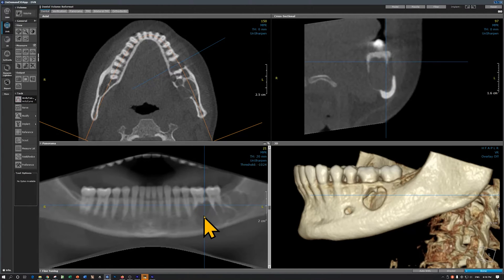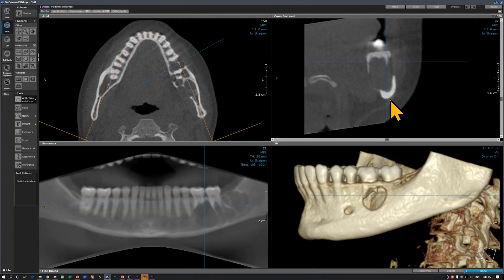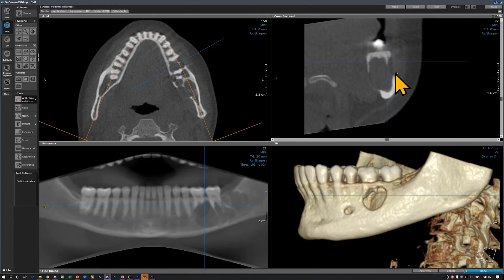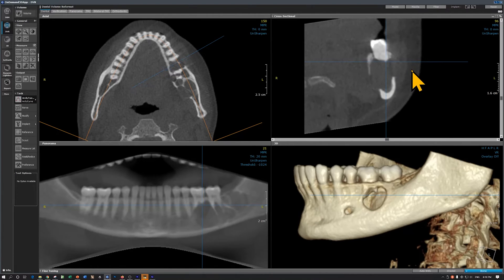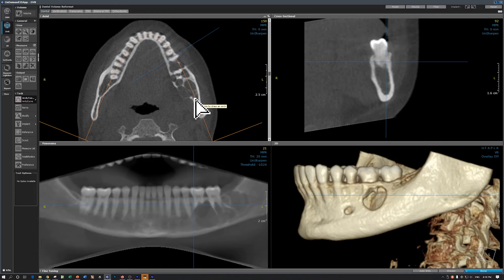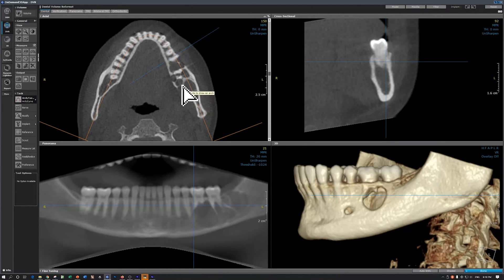Remember on the panoramic radiograph, we saw this area being very lucent. That's mainly because the buccal cortex as well as the lingual cortex are both thin or perforated. Looking on the axial slices, you can appreciate the multiple compartments.